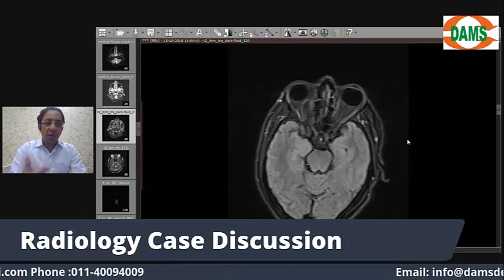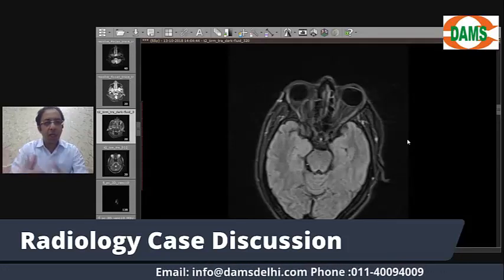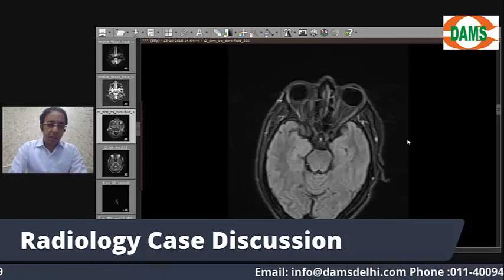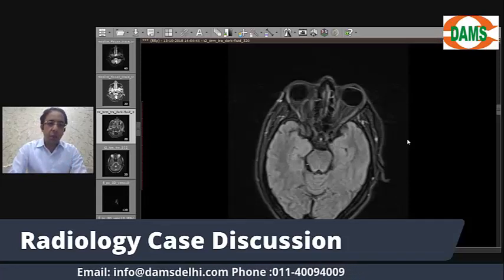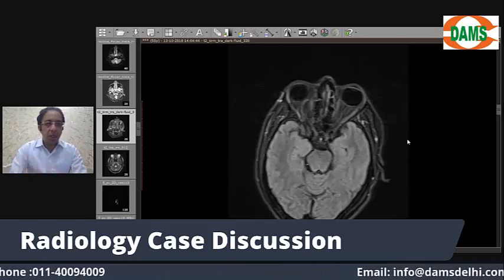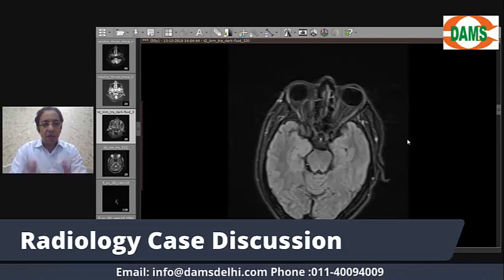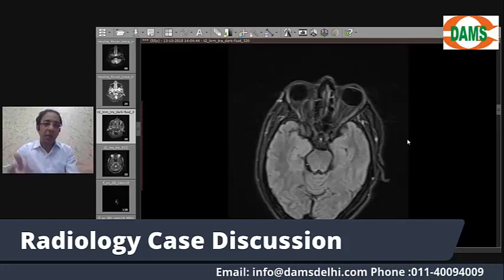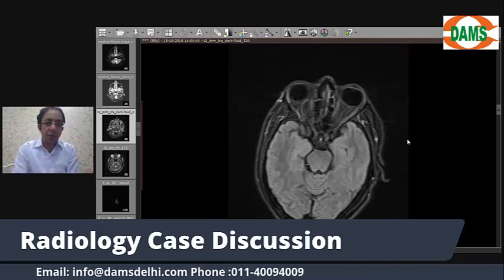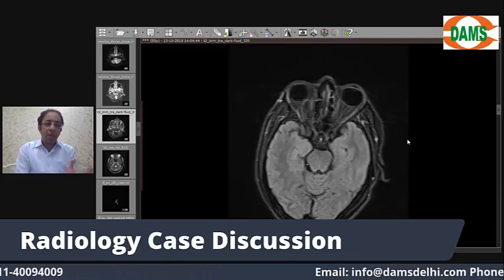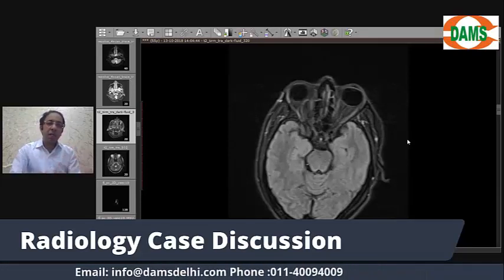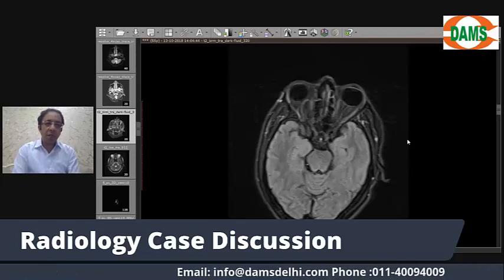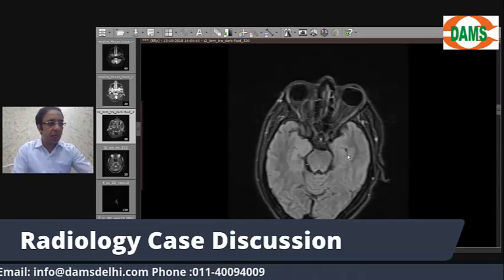Why would you have an infarct bilaterally? Usually in arterial infarction, one artery is blocked and the infarct is on one side. The bilateral distribution points toward a variant artery — a variant in the posterior circulation described by the French neurologist Percheron, called the artery of Percheron. This variant artery supplies bilateral paramedian midbrain and bilateral paramedian thalamus. If the artery of Percheron is obstructed, the infarct would be exactly in the territory we just saw. Our diagnosis is artery of Percheron territory infarction.